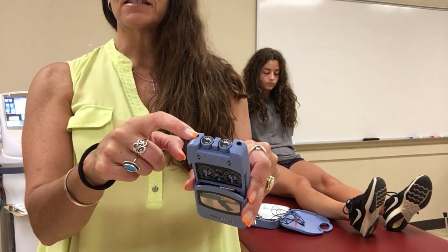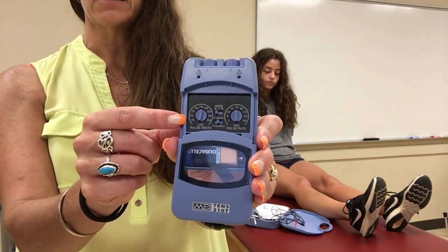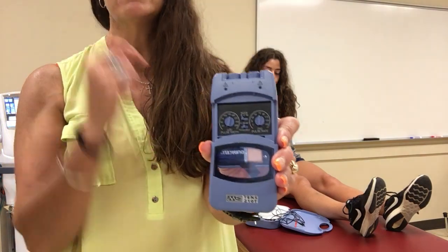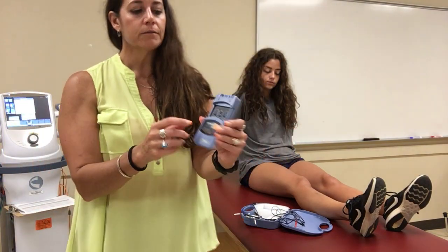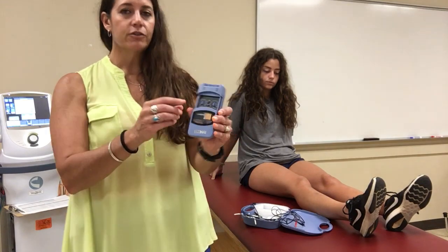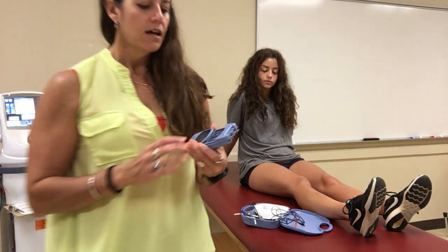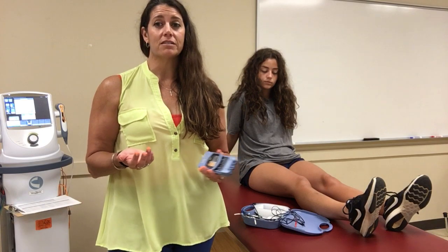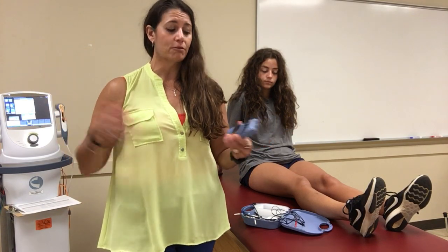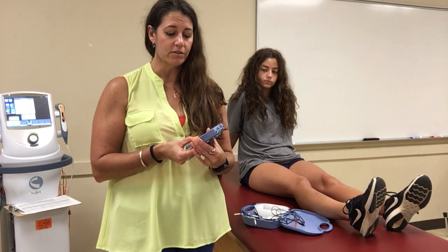When doing a single side, you're really only going to change the pulse width. We're looking at 80 to 200 for a biphasic treatment. You can also set a continuous time of 30 minutes or 60 minutes depending on what you're trying to do with your patient. A lot of times 30 minutes is enough, but sometimes they want it running longer — you just need to know why you're doing it and be able to justify it.